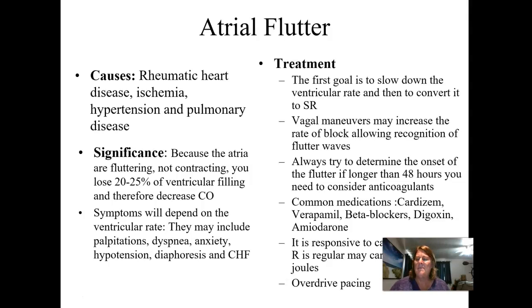Overdrive pacing is when we turn the pacemaker up higher than the patient's rate, and we let the pacemaker take over pacing the heart, and then we start turning it down, hoping that broke the cycle and the SA node can kick back in. We do not do overdrive pacing with external defibrillators. We can use transvenous pacemakers for that, and even permanent pacemakers if there's someone there who could reprogram it.